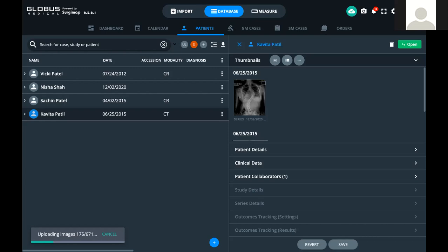So when I go into that thing, I say go click here to drop the images, right? So when I click here, it opens my desktop, which shows the BOS Surgimap Scoliosis folder, in which I am seeing all the subfolders. Okay. So when I try to select, say, Vicky Patel, when I right click or left click, the entire subfolder opens up.